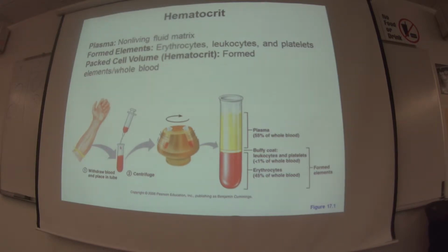You can touch it, you do whatever you want, as long as it's your body that it's contacting, or one of these plastic dishes. Just please don't touch other people's blood. But what you can do is just put your own blood on a very, very white piece of paper and basically compare its color to get a rough estimate of your hemoglobin concentration. And yeah, so that's pretty much it for our blood tests.